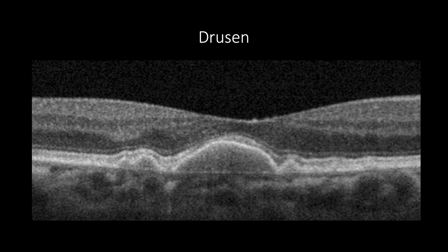OCT can accurately depict the number, type, location, and size of drusen and retinal and choroidal changes. Drusen appear in different sizes and shapes, and can have homogenous or heterogeneous content. Drusen are deposits of extracellular yellow material between the retinal pigment epithelium (RPE) and Bruch's membrane, mainly consisting of lipids and fatty proteins, and can be present as solo findings or associated with retinal or choroidal changes.